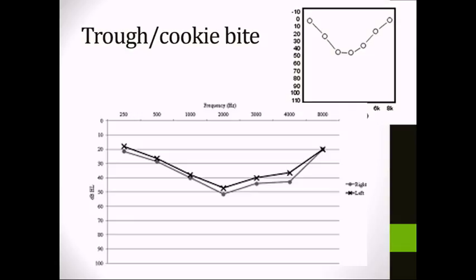And then a saucer is this same hearing loss but flipped upside down. Looks like an upside down saucer to me, but again, that's neither here nor there. So again, the saucer would look like this flipped over, and sometimes again you'll see that called reverse cookie bite in terms of shape and configuration of the audiogram.